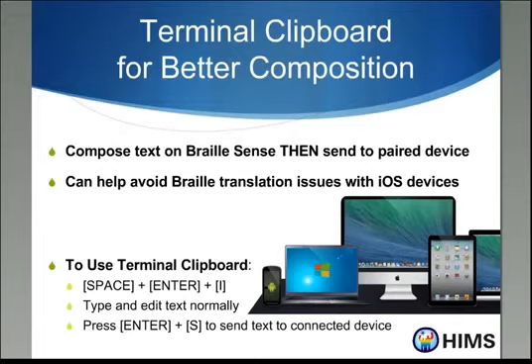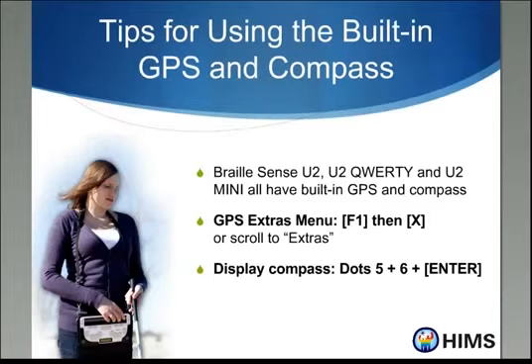It just eliminates a lot of, you don't have to learn all of the sort of Apple or Android mobile commands if you don't want to. For editing, you don't have to remember that, for example, space D is delete. You can just use your backspace. So you're using commands that you use every day. So we're big fans of the Terminal Clipboard. I rather like it. And now we're going to move on to our GPS.